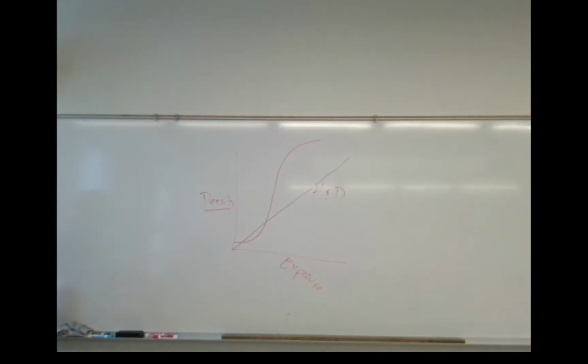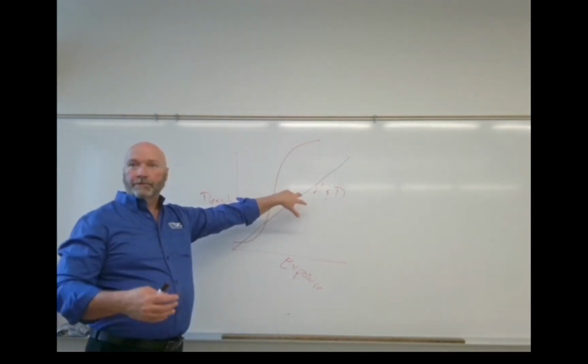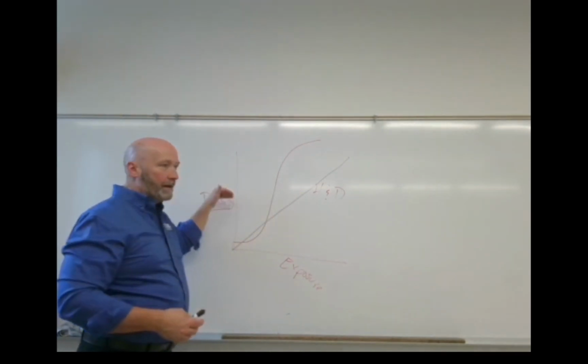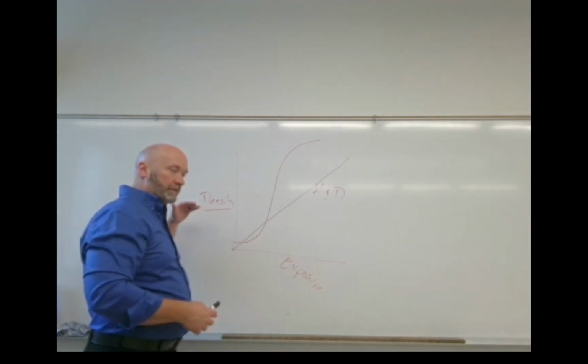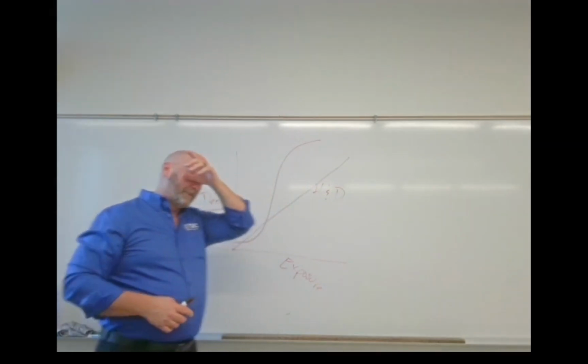Your DR systems are actually like this. The more exposure you get, incrementally the same amount of density. That doesn't relate to the contrast that you see.